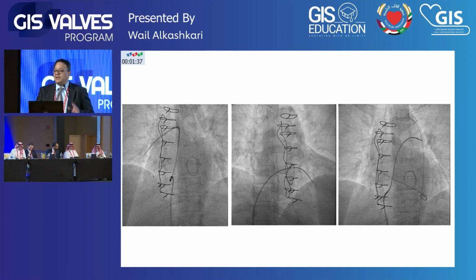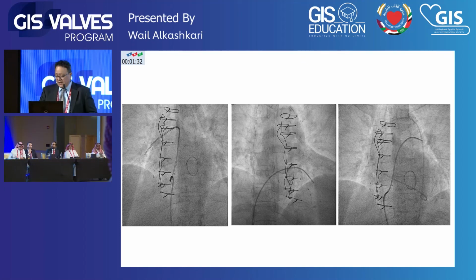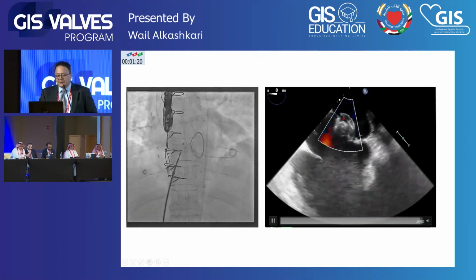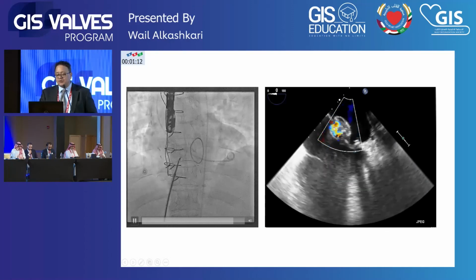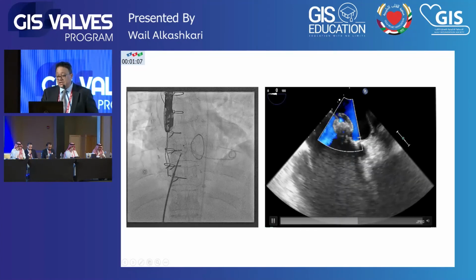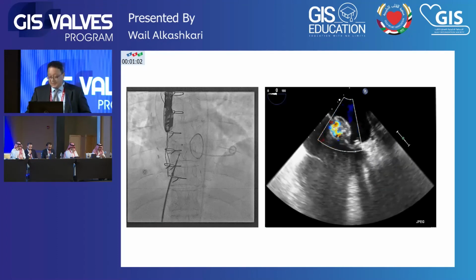And you know what? We medicated the patient for 6 months with maximal therapy. There was no ARNI at that time in 2018, and we maximized everything. We brought him back. His LVEDP, the day of the procedure, was 12. So what we did, we did a fenestration in the device. As you can see here, that's a fenestration. And we kept the device. We did not release it for 30 minutes. LVEDP was not elevated, so we released the device. Now we are in 2022. I saw the patient last Wednesday, doing great, and thank you very much.